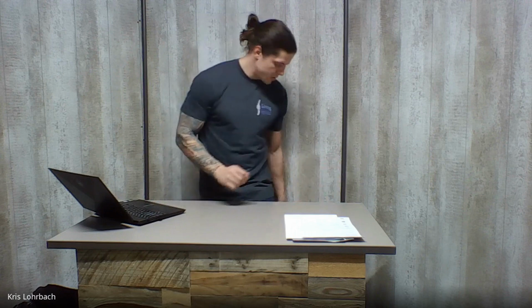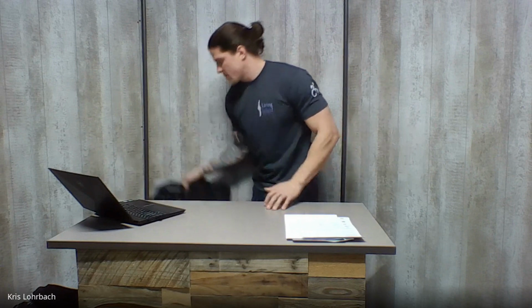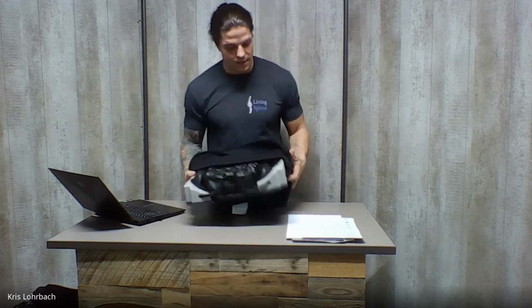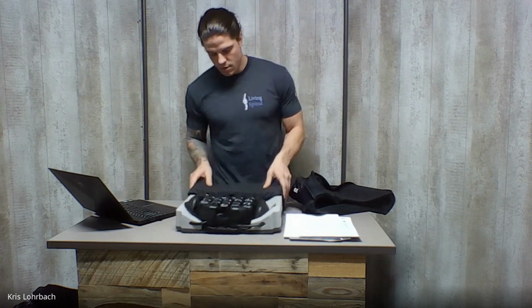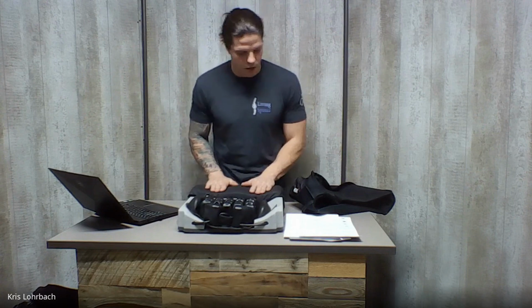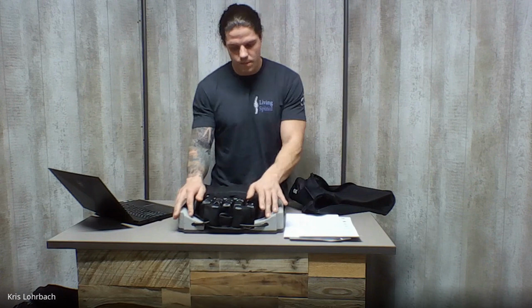Lastly, in cushion type, we'll talk about hybrid cushions. A hybrid cushion is literally just a combination of everything we just talked about, and you see it all over. A really great example here is Roho's Hybrid Elite. They use a combination of foam, gel, and air. I don't know if this is gel, but I know they do make it with gel. And their foam gives you great posturing.